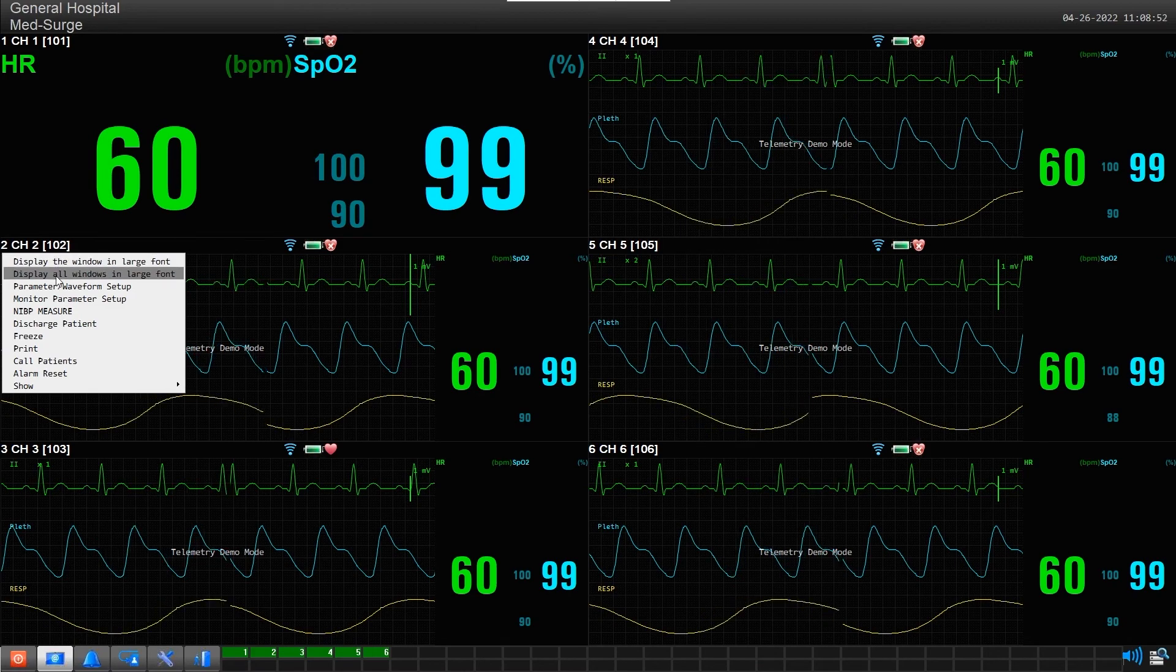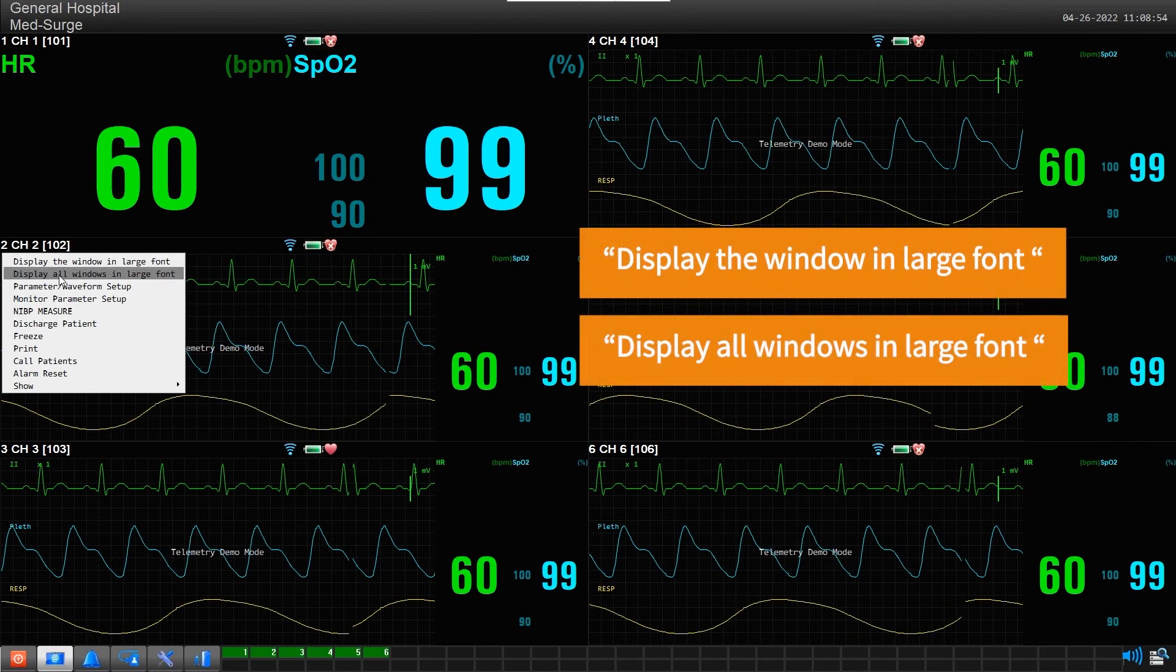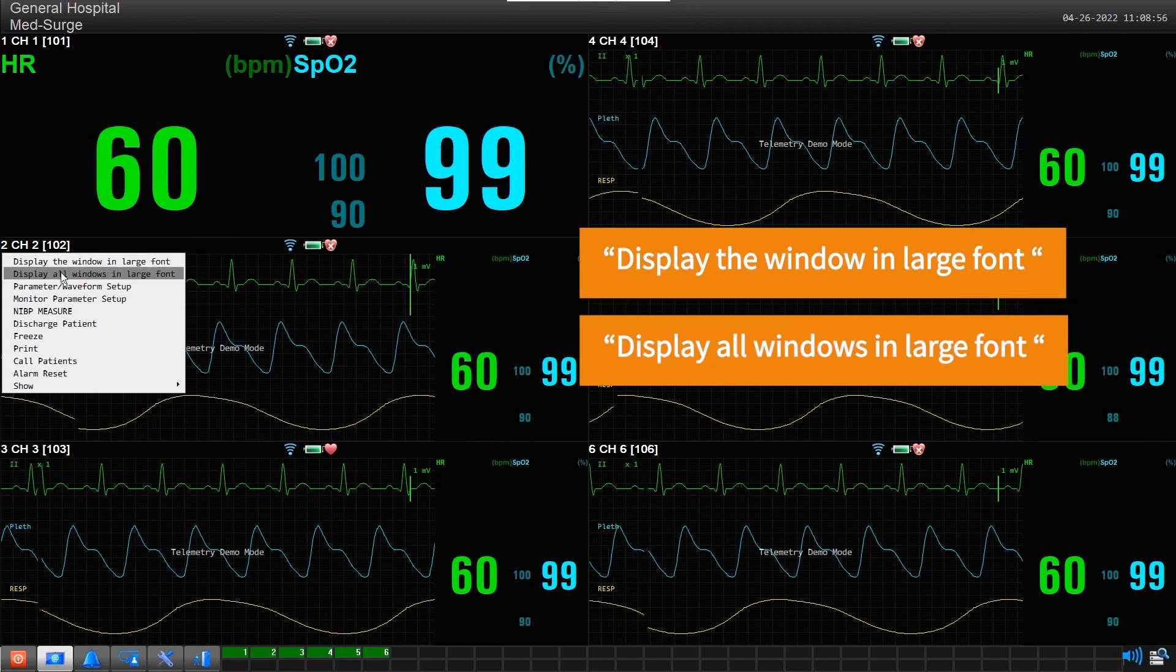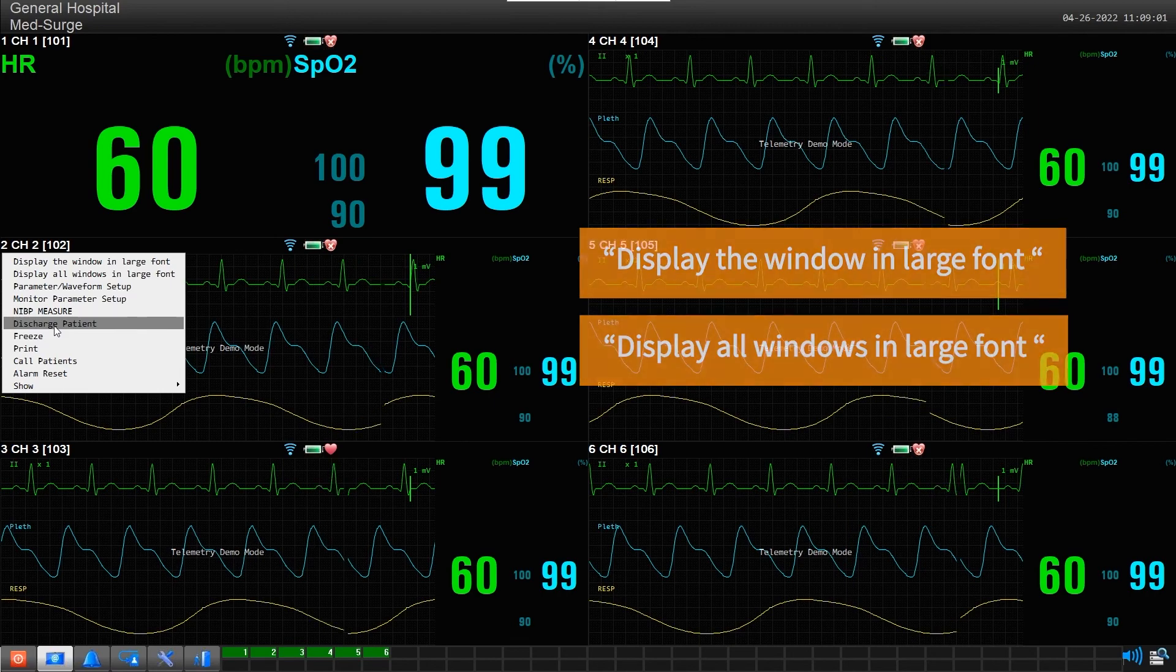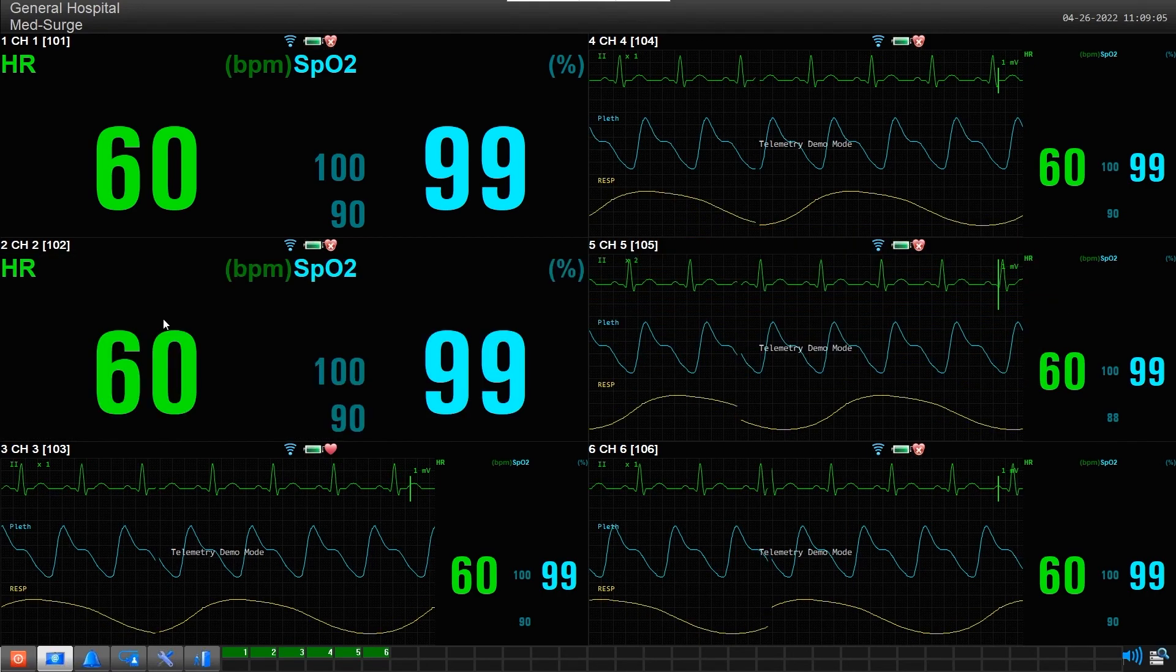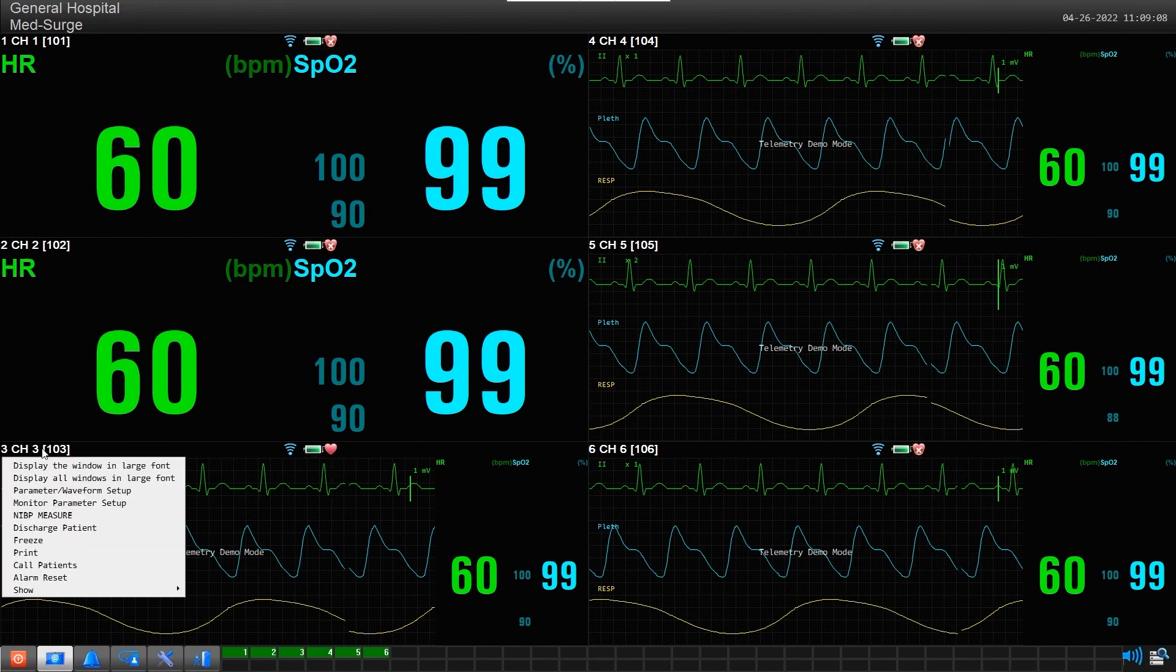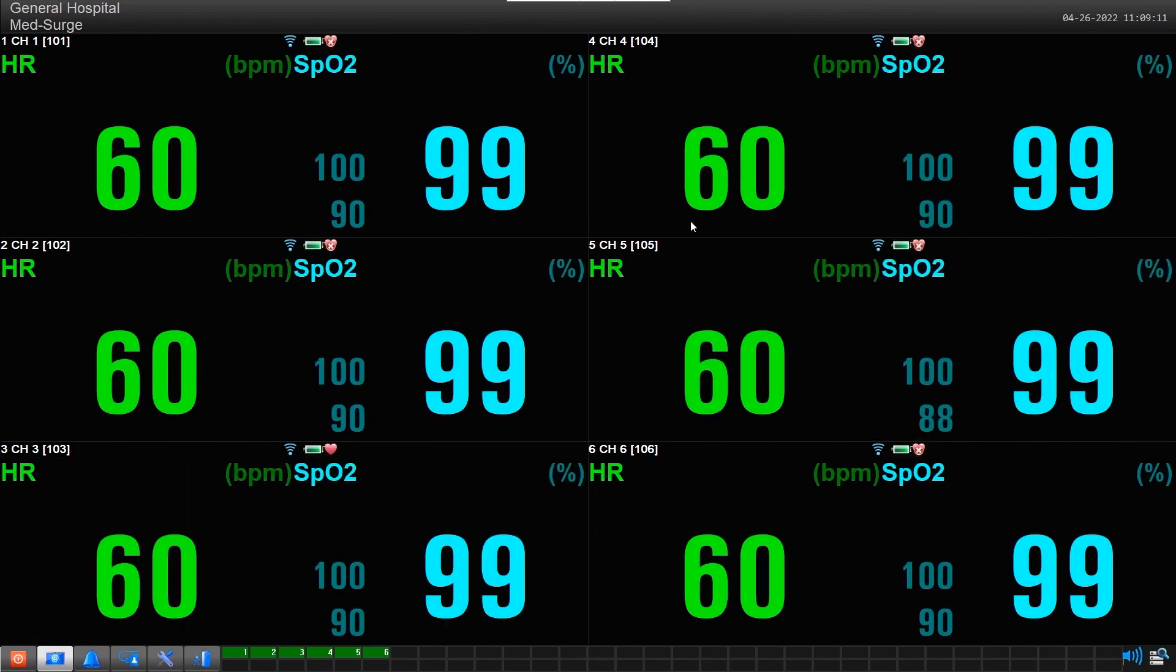Placing a check mark beside either one of these will enter that channel slot or all slots into the selected mode. Display the window in Large Font Mode will place just the slot selected in Large Font Mode. Display all windows in Large Font will place all the admitted patients in Large Font Mode.